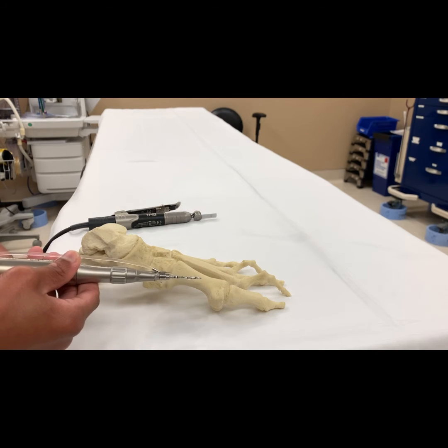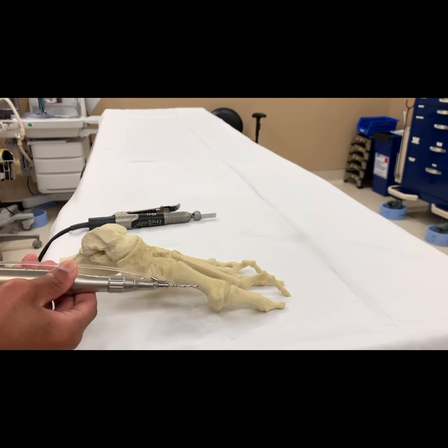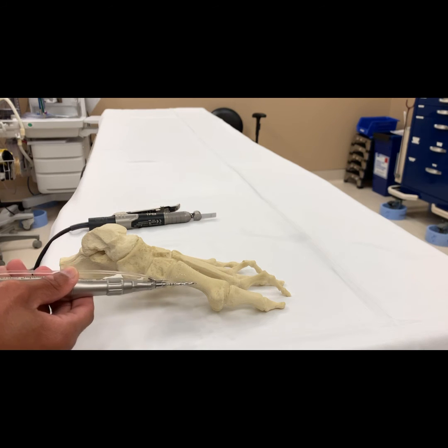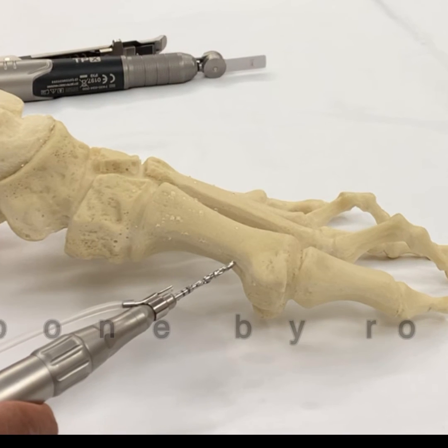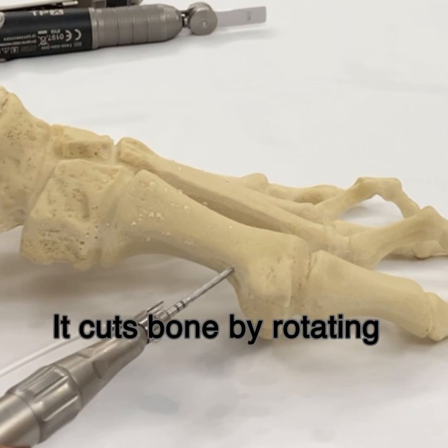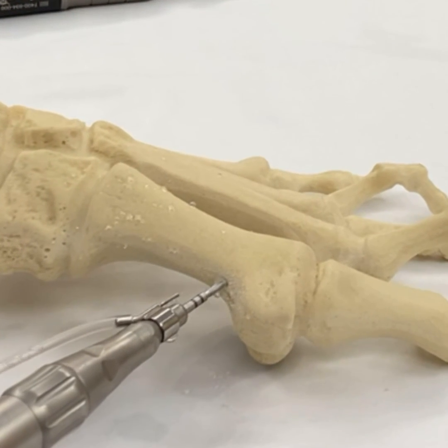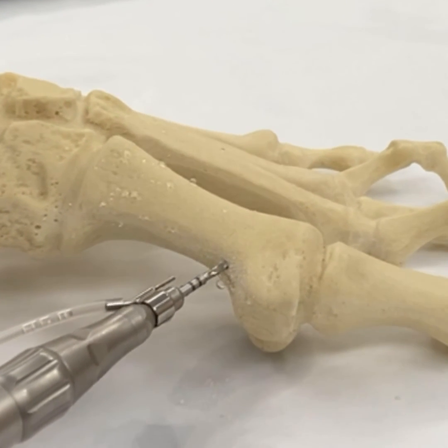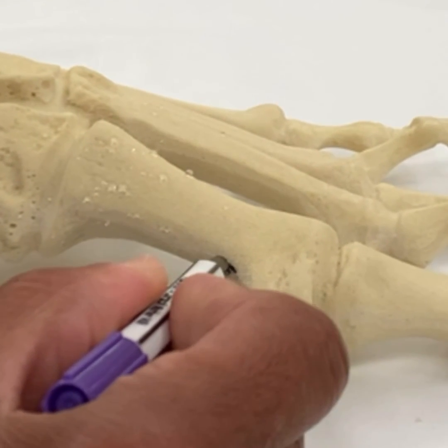Because it rotates at low RPM with high torque, which allows it to cut bone, one really only needs to make an incision to accommodate the tip of it while cutting the bone. That's it — that's my incision.